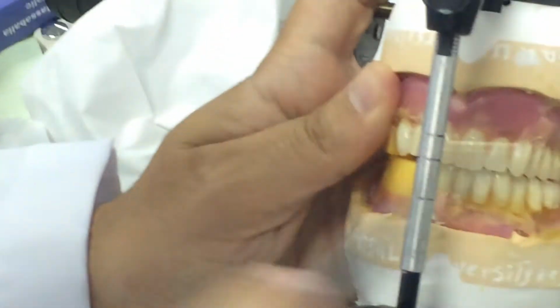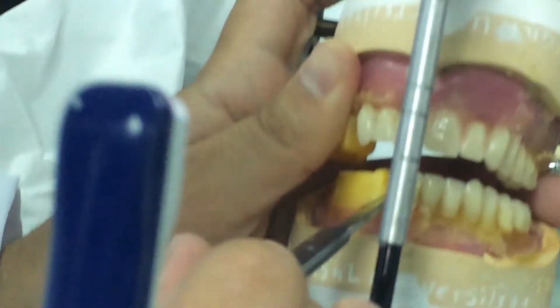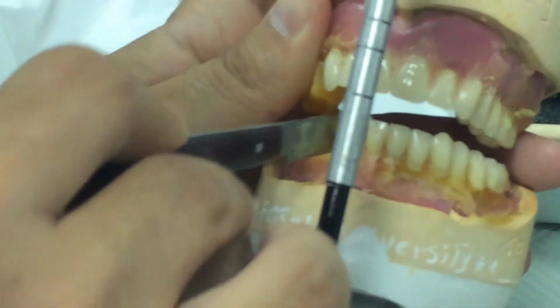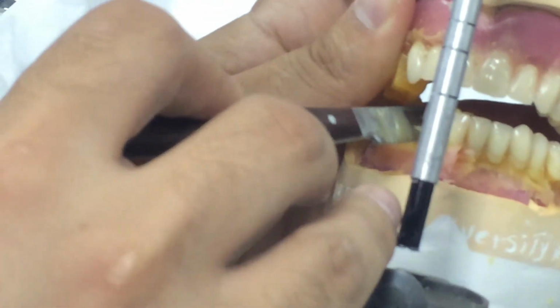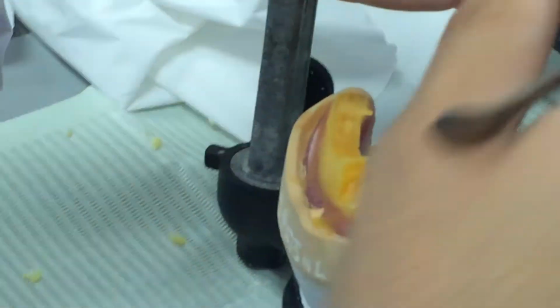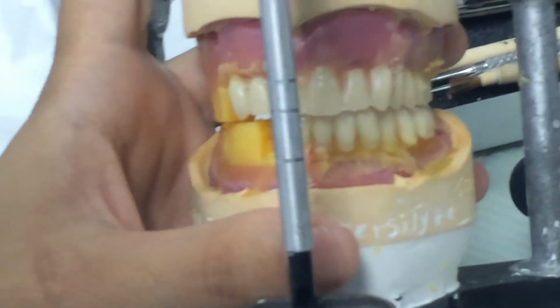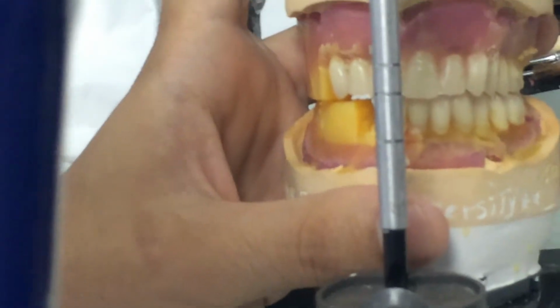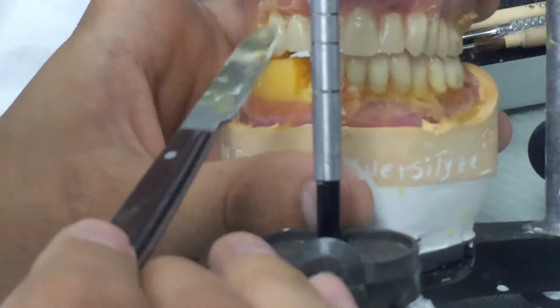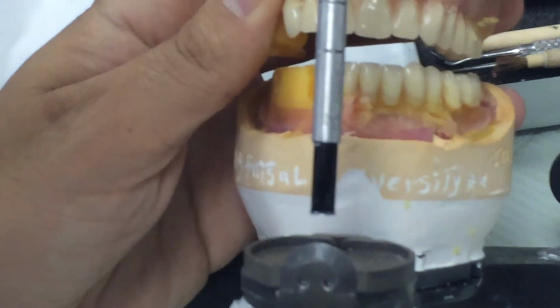If you can see, always while I'm doing setting, guys, the teeth set, or let's say the trial denture, it has to be on the articulator. I shouldn't take it out. Okay guys, the teeth has to be on the articulator at all times.